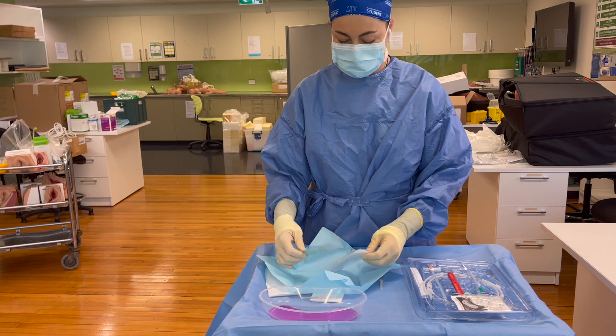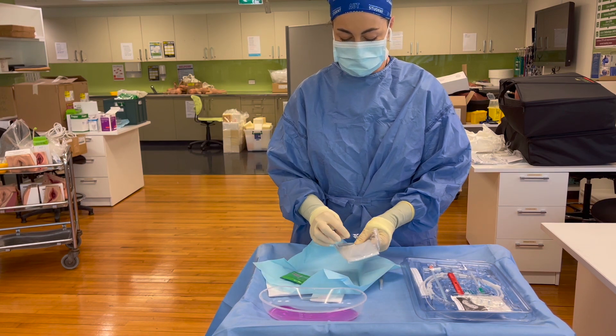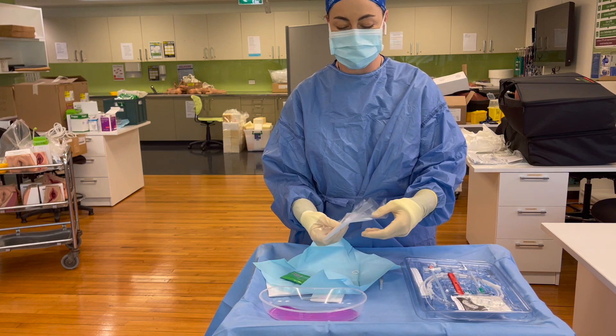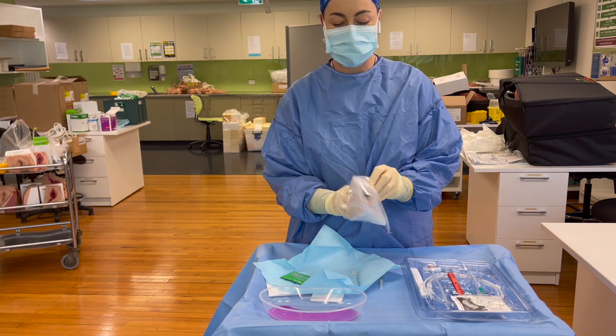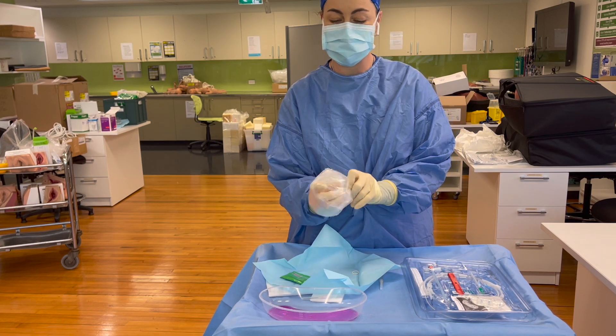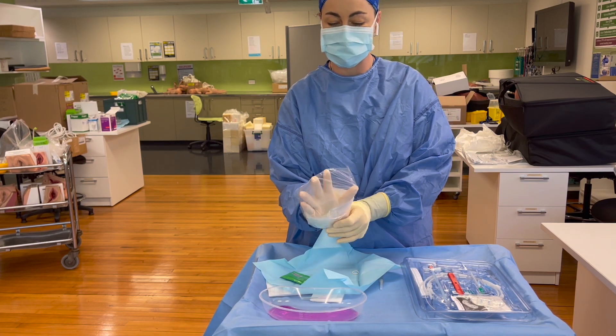Take care to extract the rubber bands so that you don't lose those, find which end is open, and pop your hand in the middle, making sure that the whole plastic bag covers your whole hand.